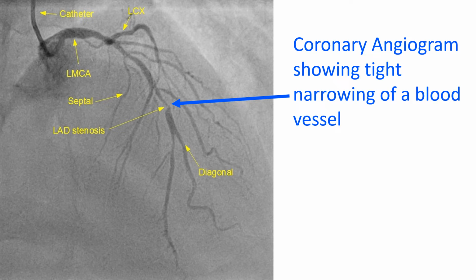Coronary angioplasty is usually done when one or more blood vessels supplying the heart are critically narrowed, more than 70% decrease in diameter. The most important benefit of angioplasty is symptomatic relief rather than improvement in survival. The procedure is done under local anaesthesia.